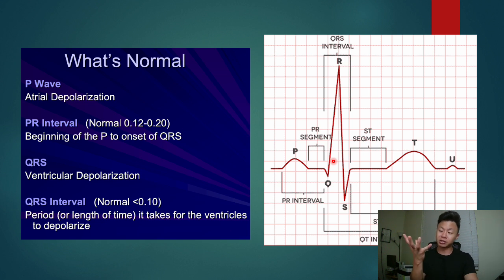The heart itself does not have to be beating for it to have electricity running throughout it, right? So whatever we're talking about, the electrical output, there's waves. We're going to call this your PQRST wave, okay? Don't mind the U just yet. We're going to talk about the PQRST wave. That is the section you're taking a look at, and you're taking a look at all these components.